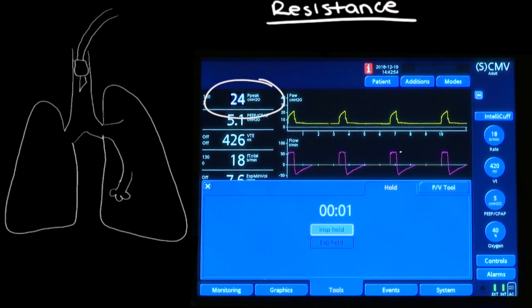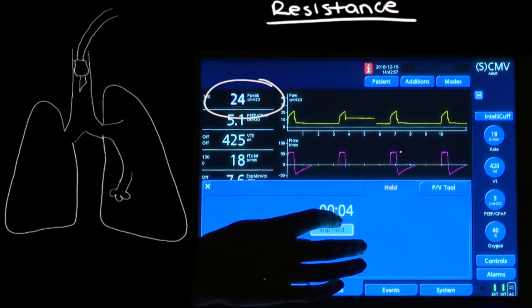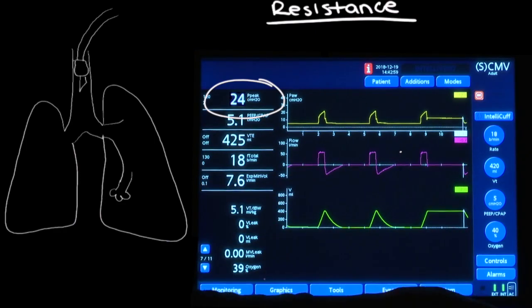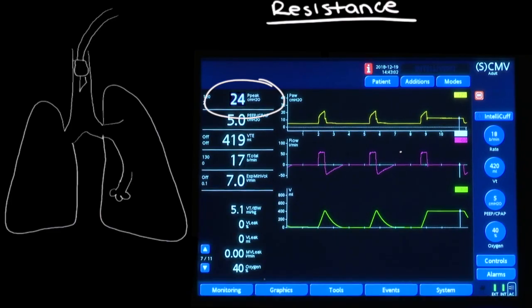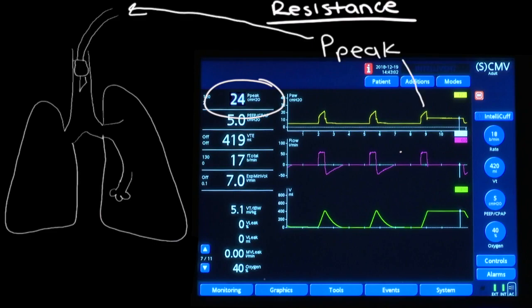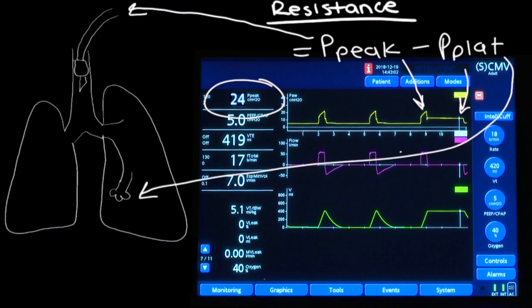Watch the pressure tracings as we do this. We move the cursor to the flat portion of the curve to measure the plateau pressure. So let's take a look back at our diagram, equation, and pressure tracing to make sense of all of this. The peak pressure is the highest amount of pressure seen in the respiratory system, and the plateau pressure is what is left over at the end of inspiration to distend the alveoli. So the difference between these two is what is lost to resistance.